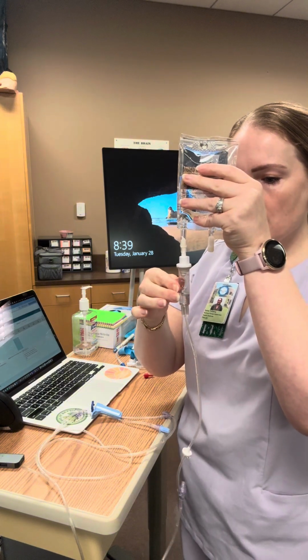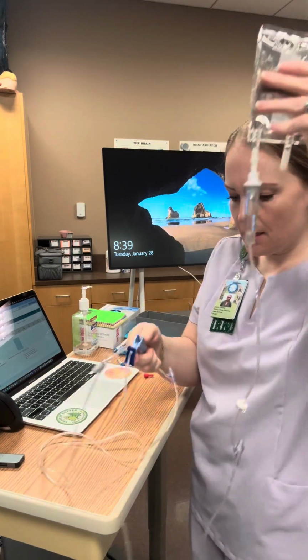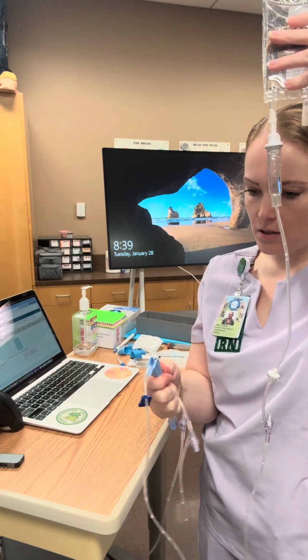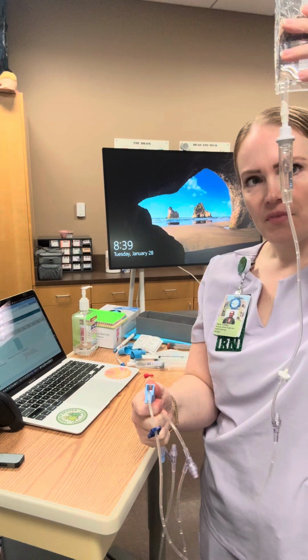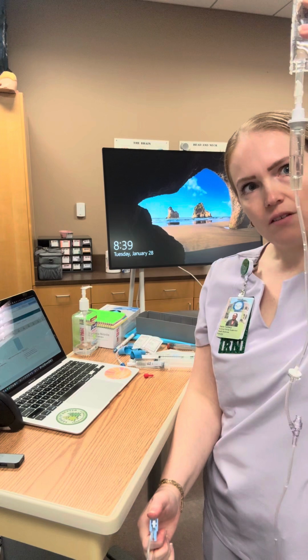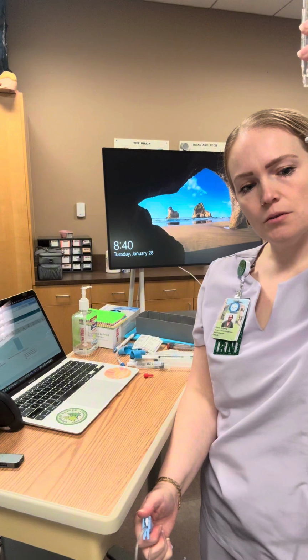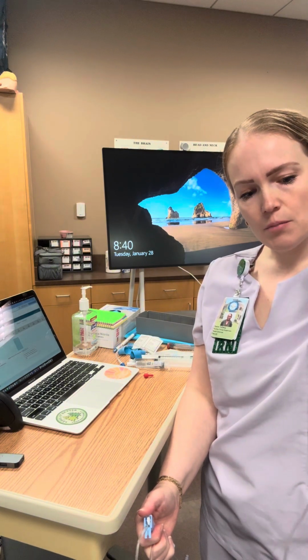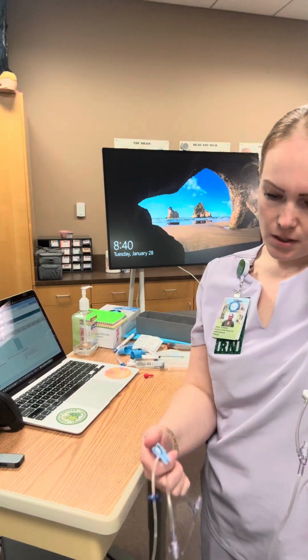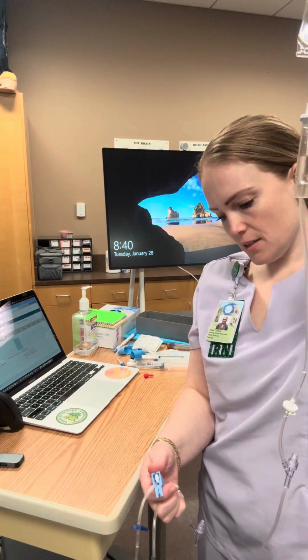If you want to hang this up on the pole, you can. Careful not to let anything drip onto the floor or drag into the trash can. I'm going to slowly undo the roller clamp and watch as my fluid rolls through. If you are struggling to get the fluid to go through, you will verbalize that you do not get any bubbles as you are getting your line prepped. Okay, so my line is prepped here.